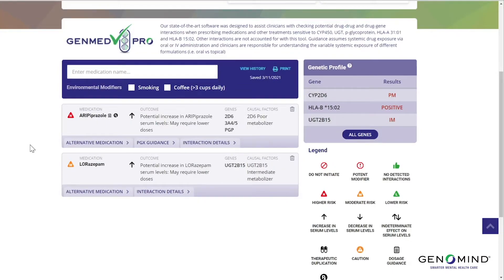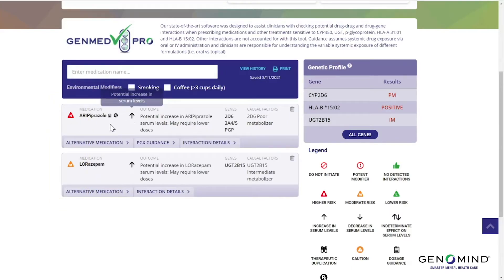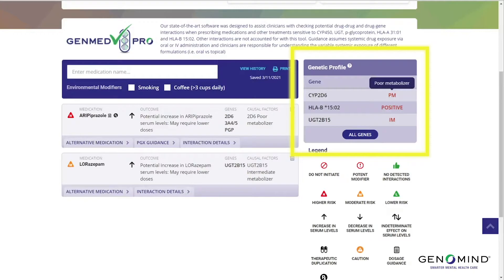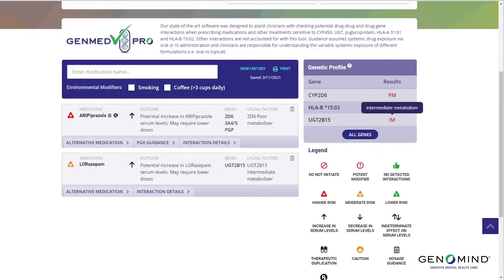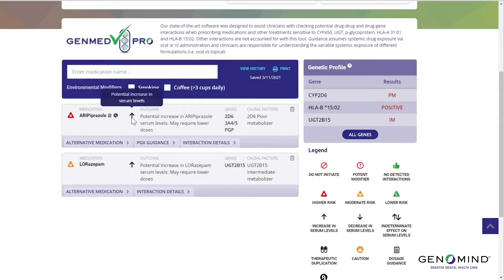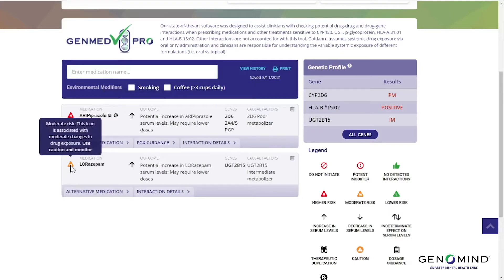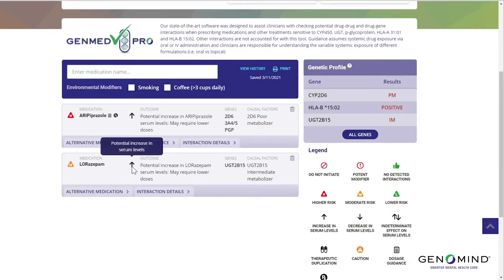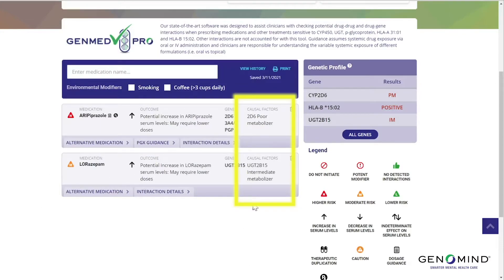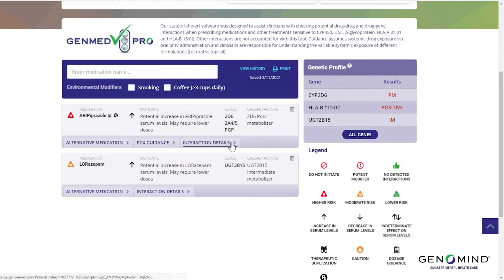Let's take a look at our first example. For most interactions, GenMedPro will generate an up or down arrow based on the influence of all genes and all drugs on the target drug, and then estimate the severity of that interaction. In this example, we have a CYP2D6 poor metabolizer and a UGT2B15 intermediate metabolizer. Aripiprazole generates a higher risk interaction — an increase in blood levels. Lorazepam generates a moderate risk interaction — an increase in blood levels. The causal factors column identifies the perpetrator of this interaction, and the interaction detail section provides a more granular view of all interaction pathways.